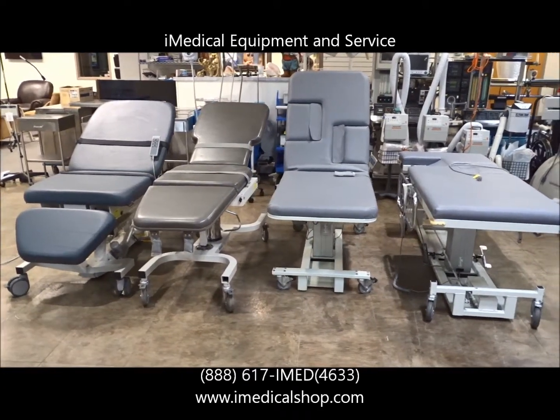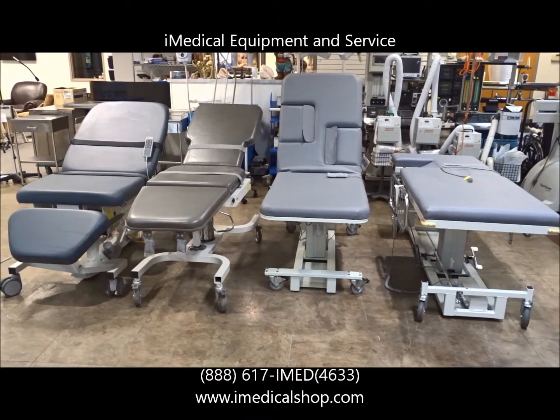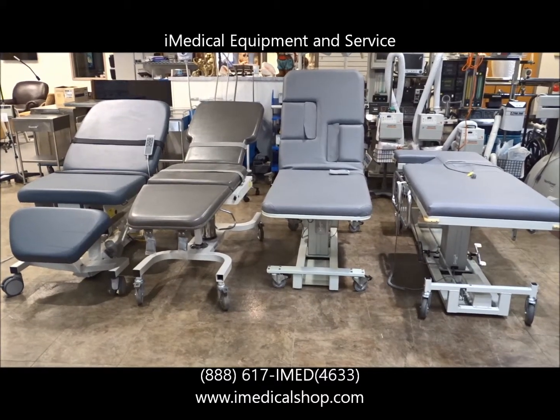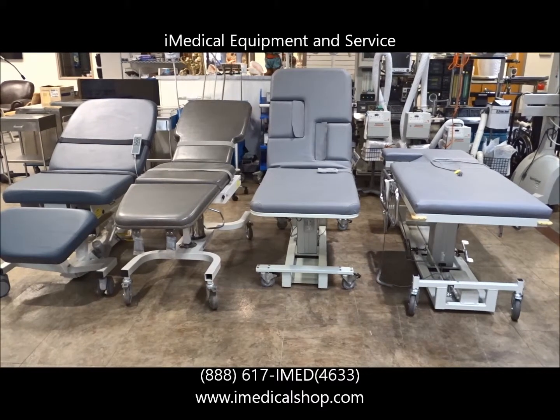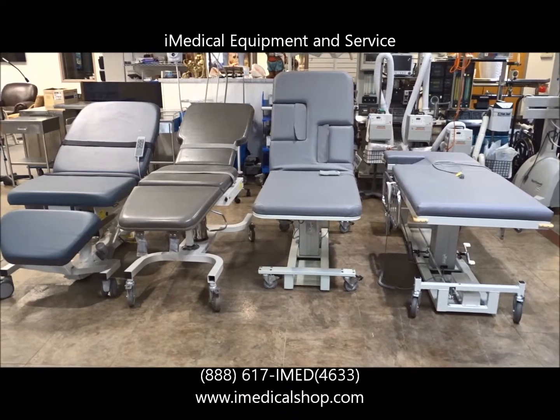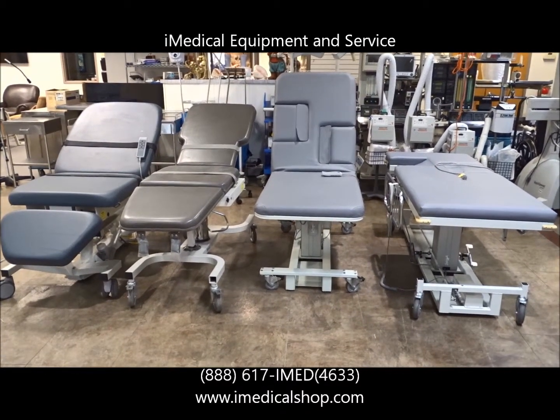We're at the iMedical Equipment Showroom in Richmond, Virginia, and we're going through ultrasound tables and imaging tables. We've got a wide variety — I wanted to get a few of them out on display because we carry a wide variety of these. We get them in constantly from various manufacturers. I've got two of the most popular manufacturers listed here.